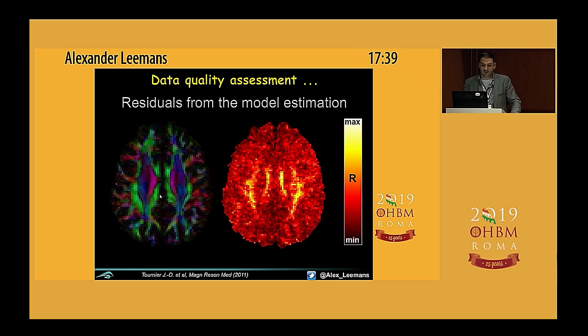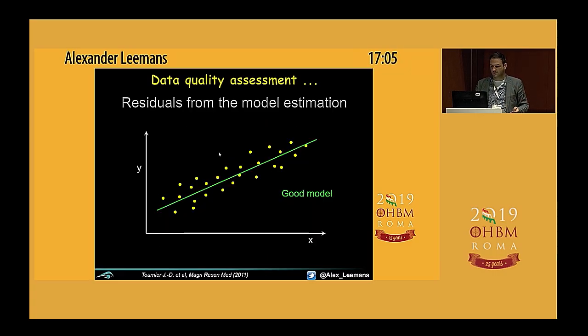And a final example showing the residual map and what it can do is, well, I'm actually showing you the residual map now, and if I ask you, what's the artifact? Oh, there's actually no artifact in the data. And then you're like, what? What have you been telling me now? Residual map artifacts? Well, there's a flip side to the coin, meaning on the one hand, residuals say something how well your model predicts your data, right? So if you have a data artifact, then your model is not going to give you a small result. It'll be big, sure. You'll get an artifact. However, what about the model? Maybe the model is wrong, right? So this would be the analogy.